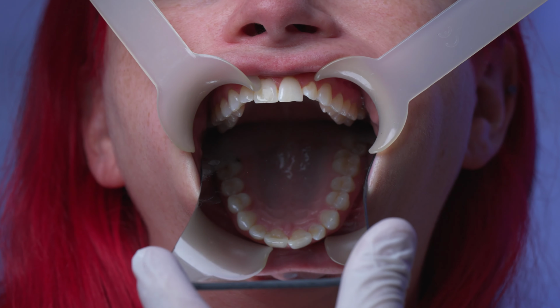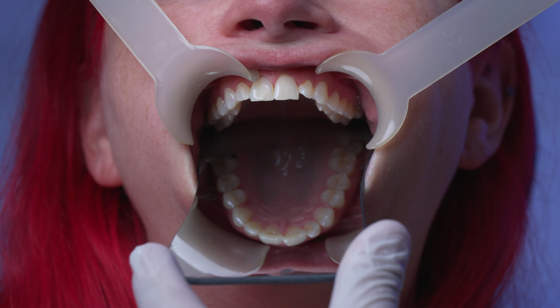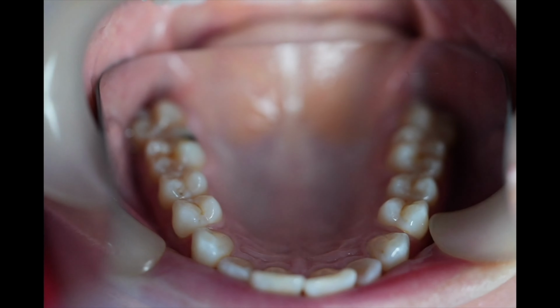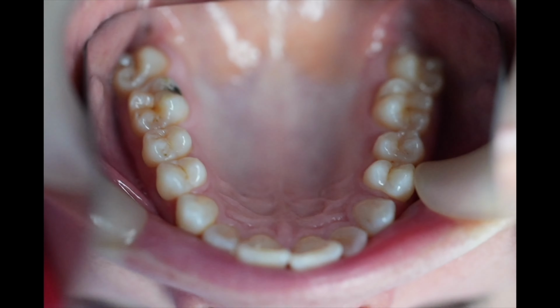You will need to continuously ask the patient to open wide, and even with the most experienced patients, everyone tends to slowly close the mouth during the process, so it's always worth reminding them to continually open as wide. If you can see too much of the anterior surface of the teeth, the patient will need to open further.